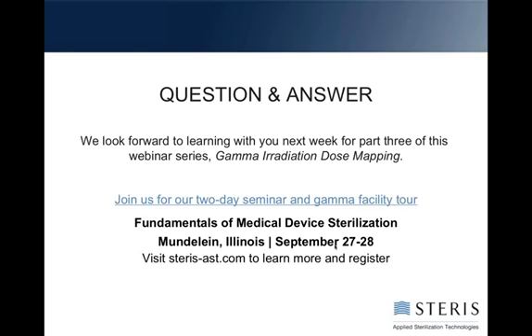All right, and the next one is, if 2 components are packaged separately but are used together in a procedure, do you add the bioburden together to establish the verification dose? And are there any cases when the bioburden can be treated separately? You can actually do it either way. I see some people that will validate them as 2 separate products for one really good reason.